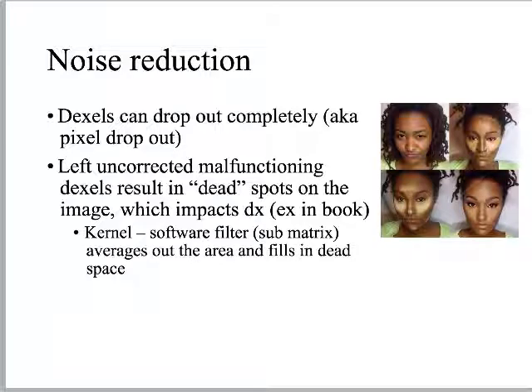So we can actually reverse, knowing that black should be black and white should be white, we can flip those around to see, okay, did it change that one area? If it didn't change that one area when I toggle the colors, then I know that area needs to be corrected, right? I'll leave it at that.